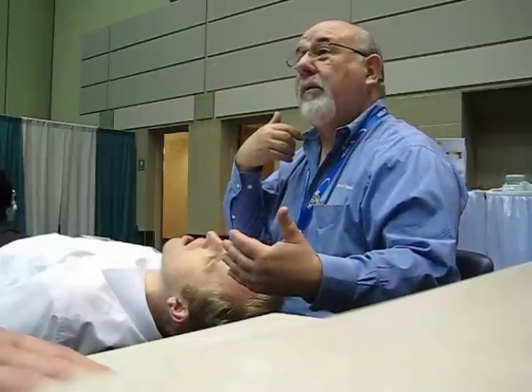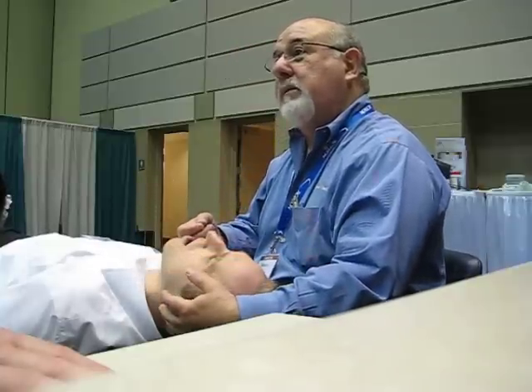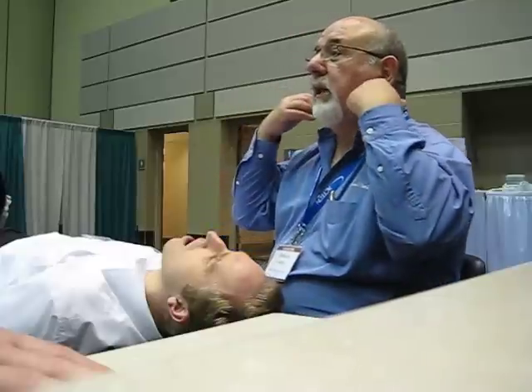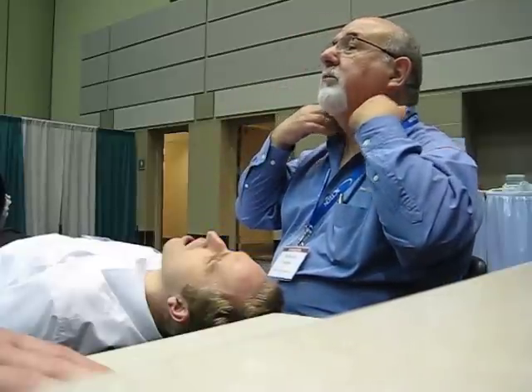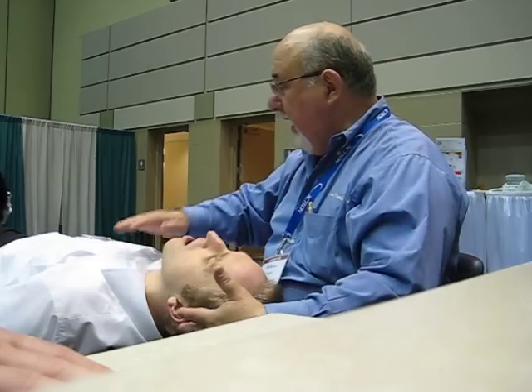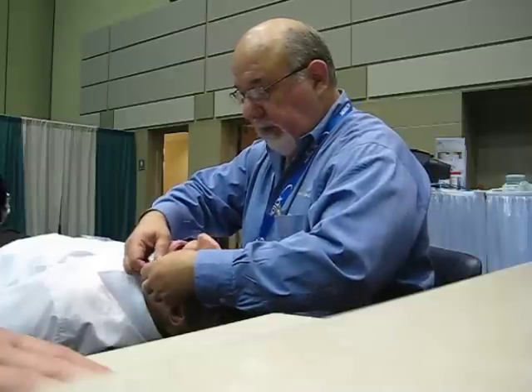It won't swallow. So now your HVE tip isn't hitting my handpiece, which allows me to have better access. The other thing is, we're all like little chipmunks. We have these pouches built into us. So when we go back into this position, where we have knees to nose as the goal, look at that. I'm not even in his mouth. Can you imagine what it would be like to retract with an instrument?